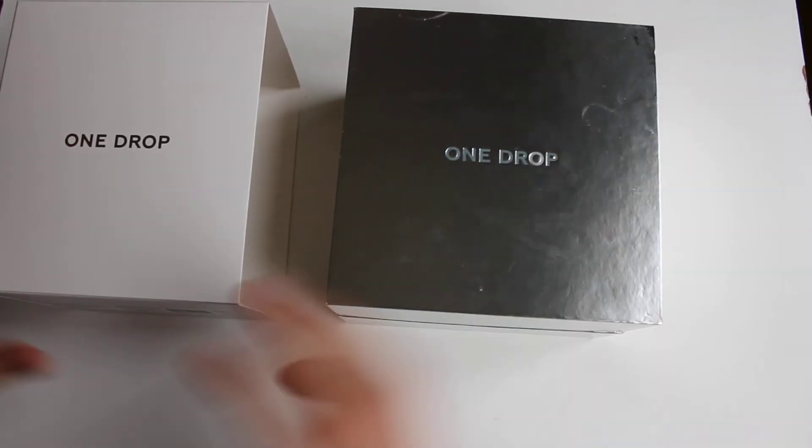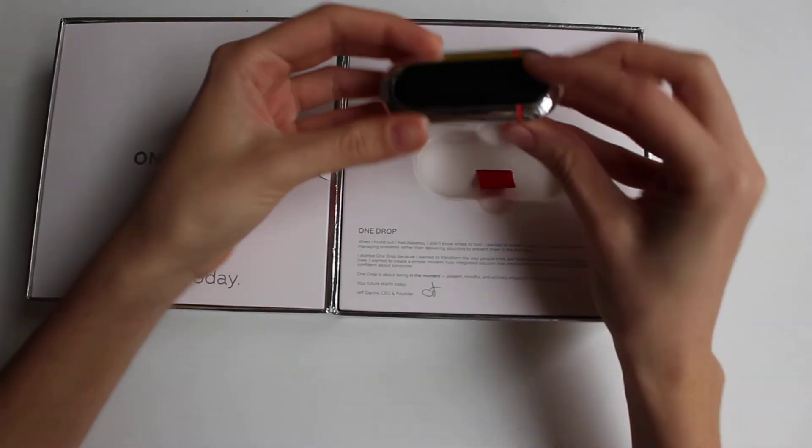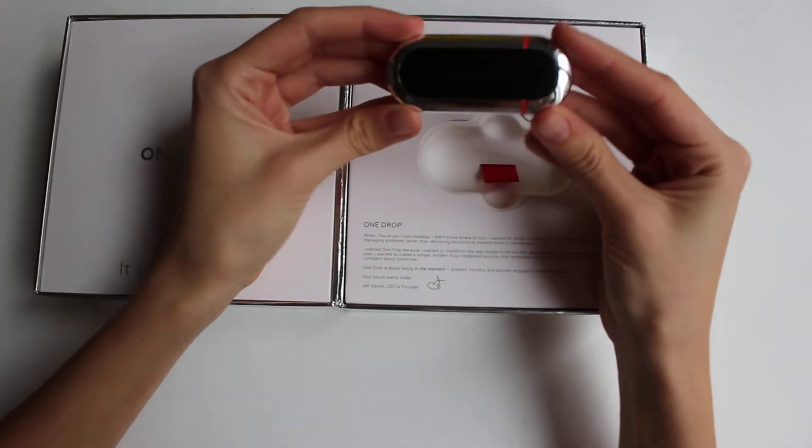It's a beautiful packaging. This is the meter — it's very sleek and beautiful.